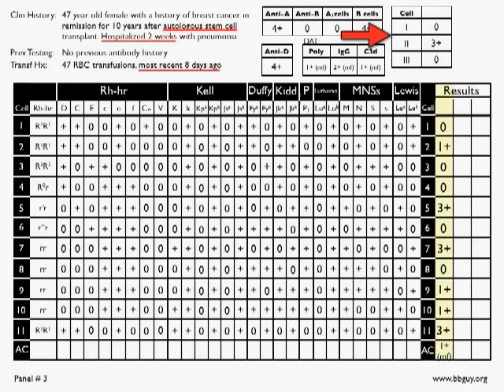People who are using gel and solid phase tend to not label. It's not universal by any means, but it's common to see the results not be labeled. If they are labeled, they would be labeled AHG. So that certainly could be liquid in a laboratory that's decided only to read at AHG, and that's totally fine. But more commonly, in my experience, that's either a gel or a solid phase lab. If you look down at the bottom, with gel, you won't see a positive control or negative control. With solid phase, you generally will see that. So this is probably gel that we're seeing here. It's not definite, but it's probably gel.